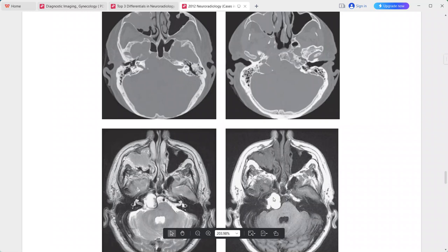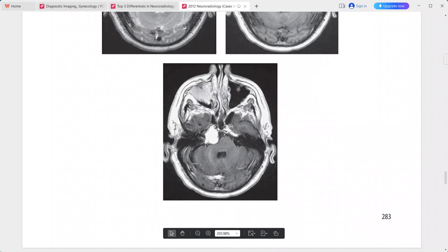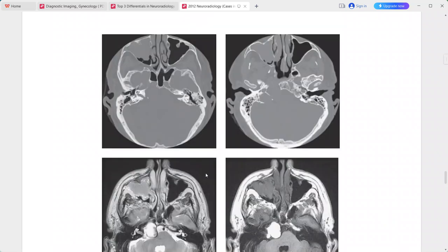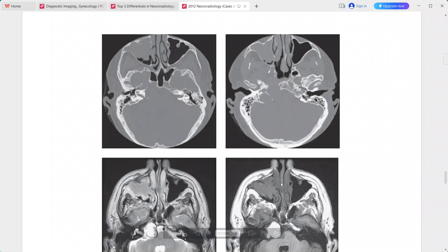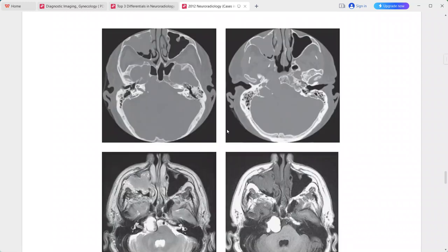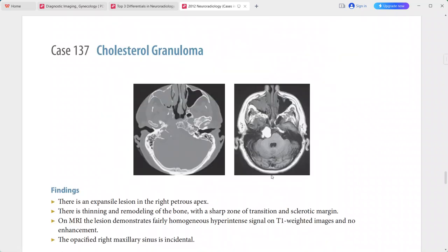The lesion is homogeneously hyperintense on T1 with no enhancement on post-contrast sequences. There is also an incidental opacified right maxillary sinus. The main lesion is a typical imaging picture of cholesterol granuloma — hyperintense on T1 consistent with fat/cholesterol. Differentials include congenital cholesteatoma, trapped proteinaceous fluid in petrous air cell, mucocele of petrous air cell, metastasis, and multiple myeloma.